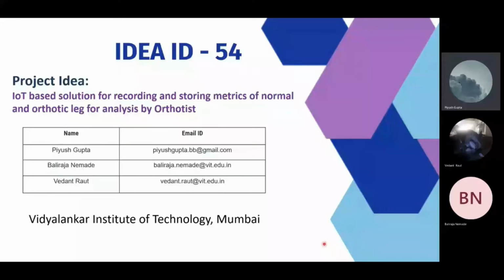So our project idea is an IoT-based solution for recording and storing metrics of normal and orthotic leg for analysis by the orthotist. Our team members consist of myself, Piyush Gupta, Baliraja Nemade, and Vedant Raut. We are from Vidyalankar Institute of Technology, Mumbai.